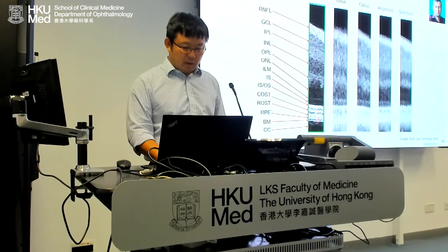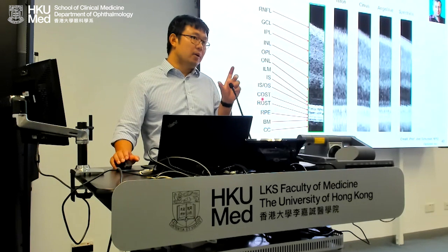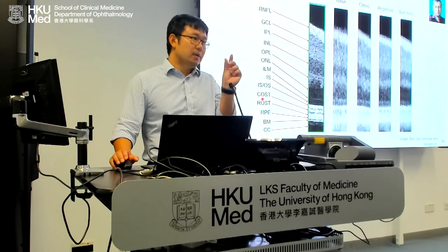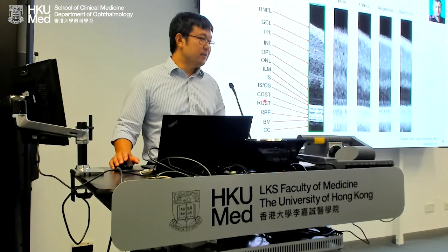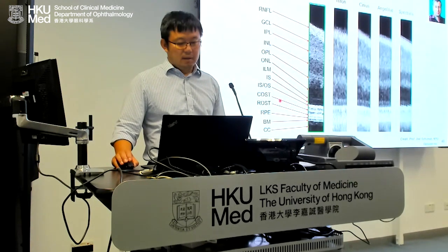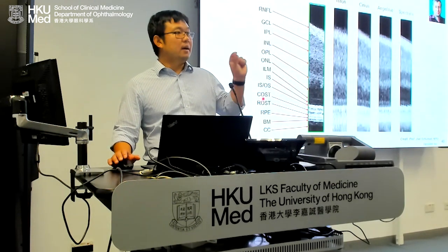So the outer retinal layers, look at the COST and ROST. They're called rod and cone tips. All these were only visualized by adaptive optics within a small field of view. But in visible-light OCT, you just get it. It's there. And it's up to the physicians, Chris, it's up to you how to use it. I'm told that when the ROST and COST two bands disappear, it is one of the earliest signs of aging.